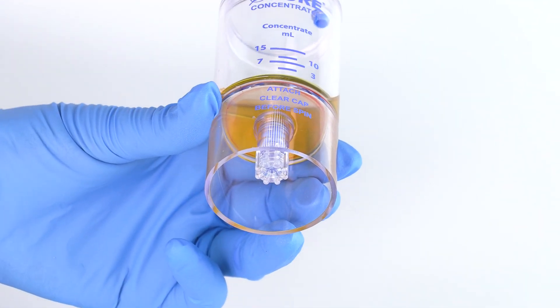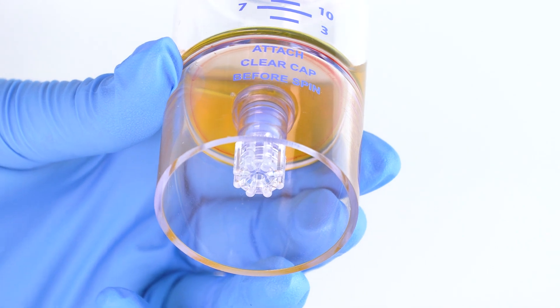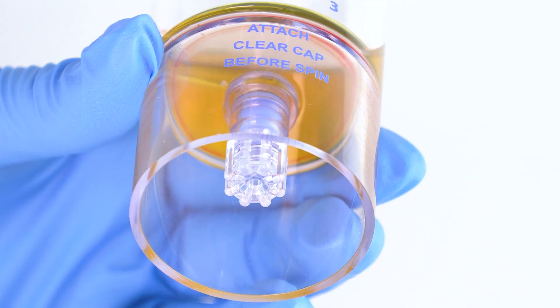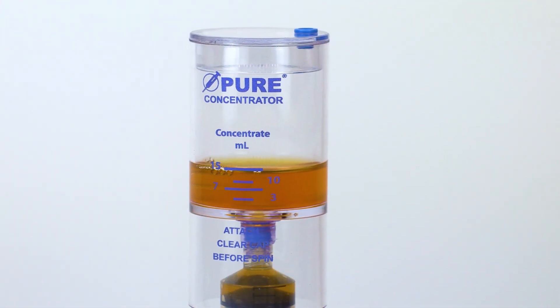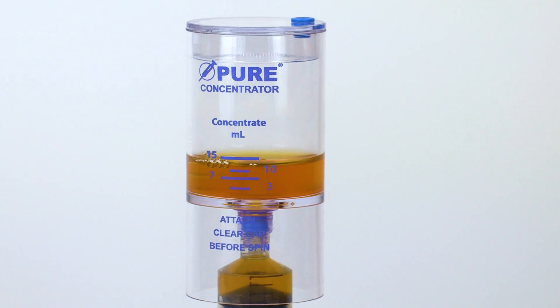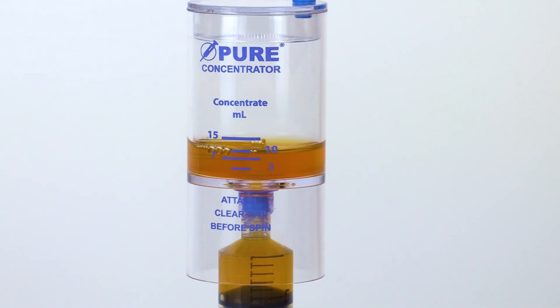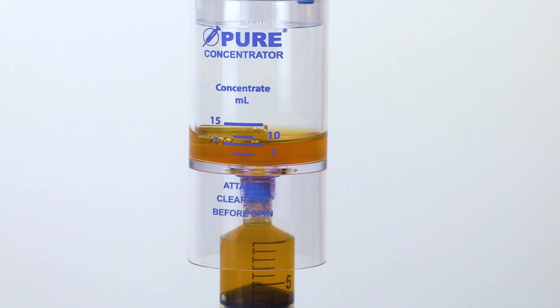After centrifugation, the platelet buffy coat layer will be clearly visible at the bottom of the device. Attach a sterile syringe to the needleless port and aspirate plasma, leaving 3 to 4 milliliters, or the desired amount, in the device.